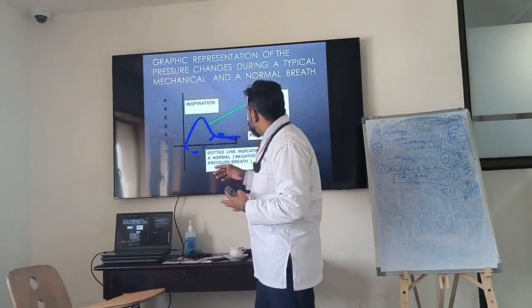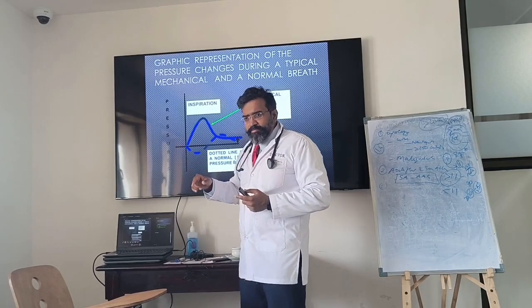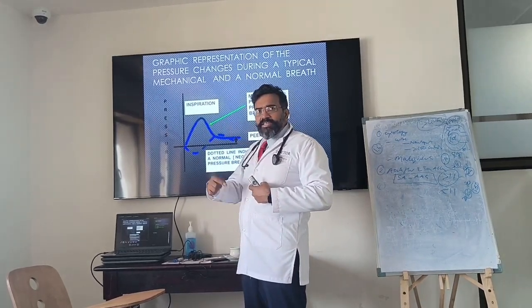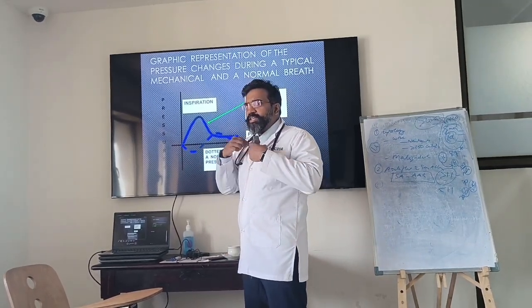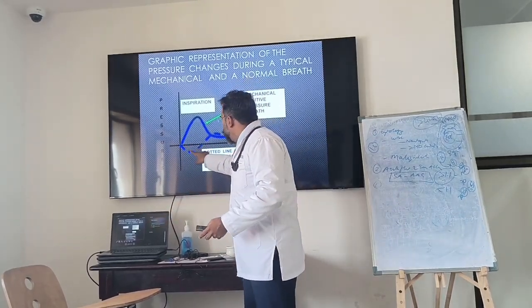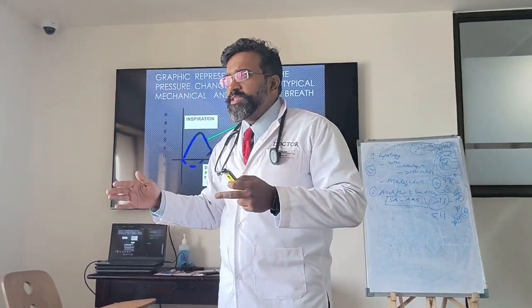If you look at spontaneous inspiration, what is going to happen? The pressure is first going to become negative. That's why you breathe like this, it becomes negative. That is why air is going from outside to inside, because inside it is negative. So negative pressure, and then as air goes inside, there is an equalization of pressure and there is an expiration. So inspiration, expiration. That's what you must understand. In the scalar, you have inspiration and expiration when there is spontaneous breathing.